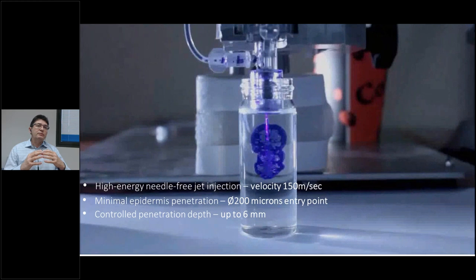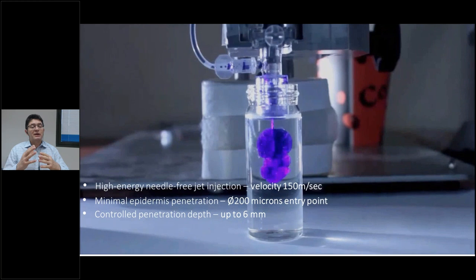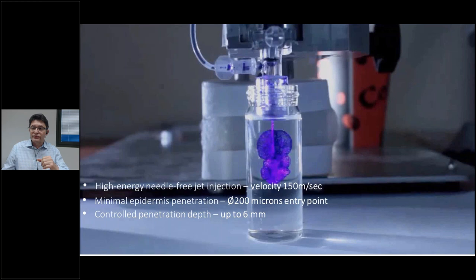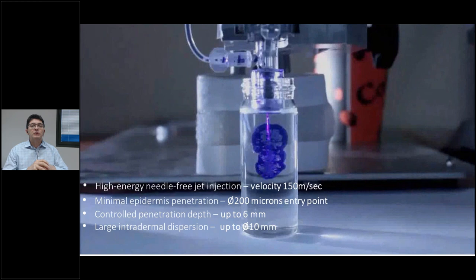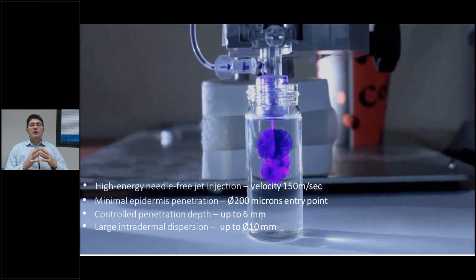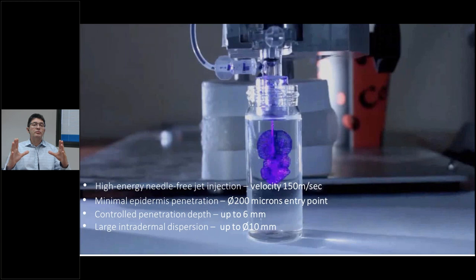So it means that we can reach not only the superficial dermis, we can reach the deeper dermis, we can reach some subcutaneous areas, or in the case of large bulky scars, we can even reach the core of the scar, which is therapeutically very attractive. The average area of dispersion is approximately 10 millimeters, or 1 centimeter, because in some skin conditions it might be much more. Let's say when we're dealing with well hydrated young skin, it is more, while with more aged dehydrated skin, the maximum area of dispersion is less than 10 millimeters.